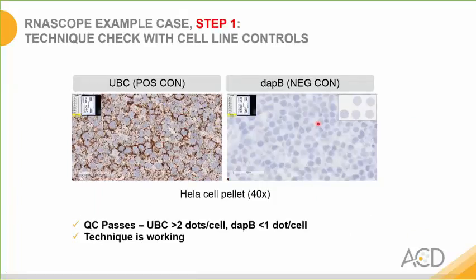The following example case provides a step-by-step review of the QC process. In step 1, a technique check with the cell line controls is performed and shows abundant UBC staining in the positive control panel on the left and absent DAP-B staining in the negative control on the right. QC clearly passes, showing that the technique is working in that particular laboratory.